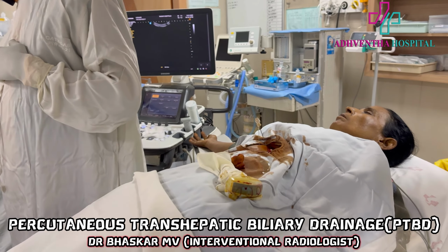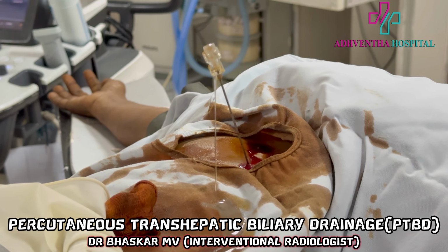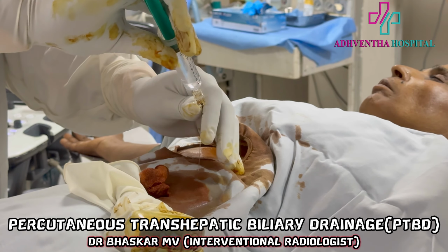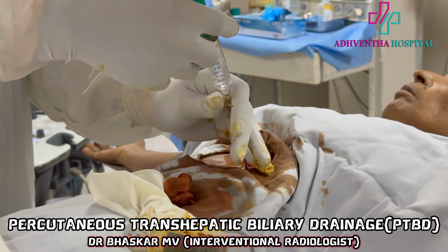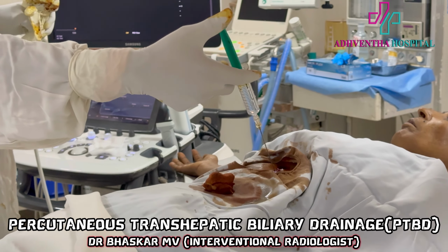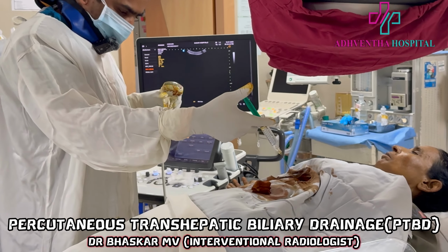I want the wire. So first I want contrast. Where is the contrast? So this is the biliary radical. Now take a shot with cholangiogram. All are wearing aprons. Okay. I want the fluoroscopy pedal.